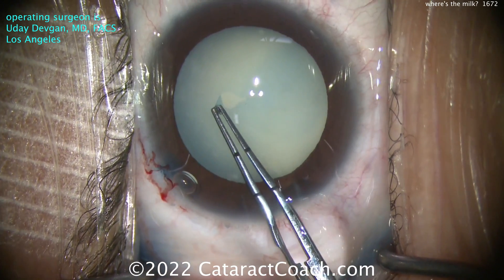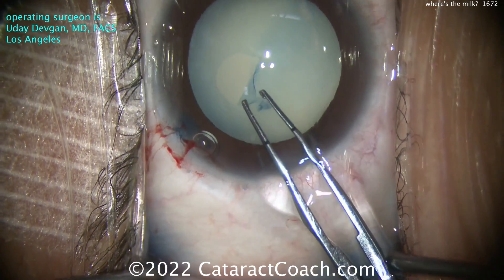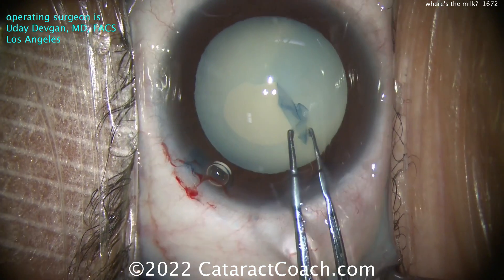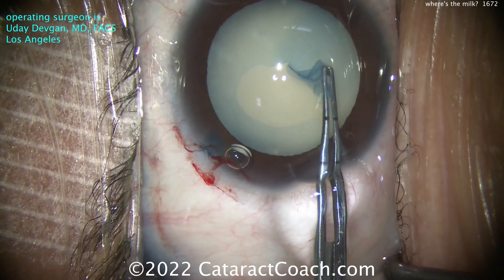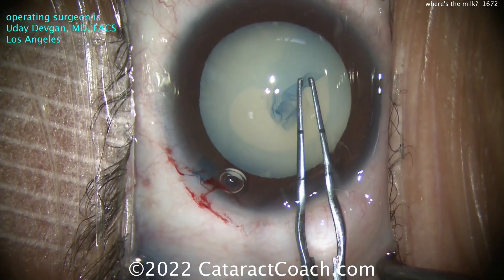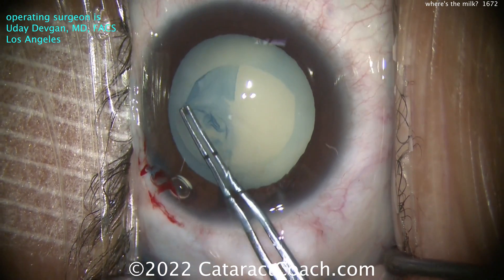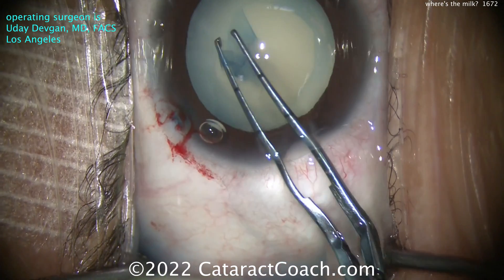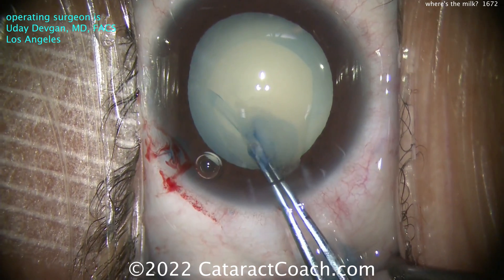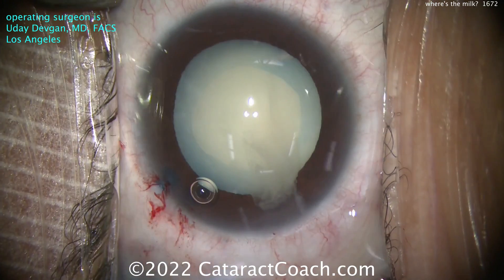By looking and touching that anterior lens capsule, it's not really pressurized. As I start with the rhexis, look - it's easy to control. There is no milk coming out, no liquefied lens cortex. In this case the lens cortex is still solid, and as a result we're able to get this rhexis done without posterior pressure. Risk of Argentine flag sign is very, very low. We'll complete our capsulorhexis aiming for about a five to five-and-a-half millimeter capsulorhexis - and there you go, beautifully done.